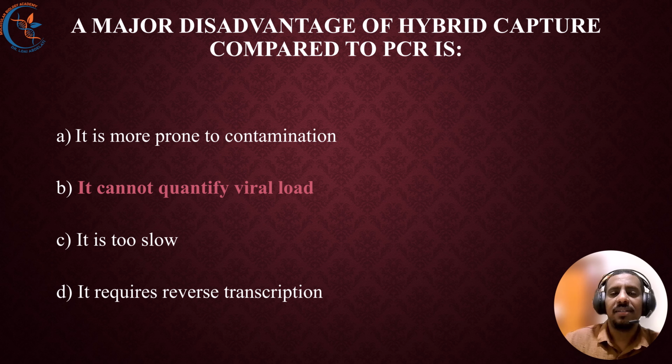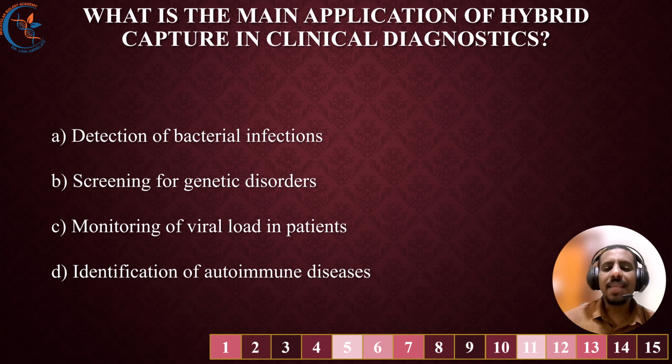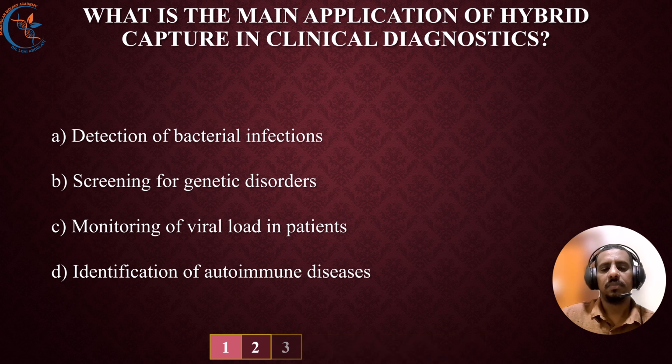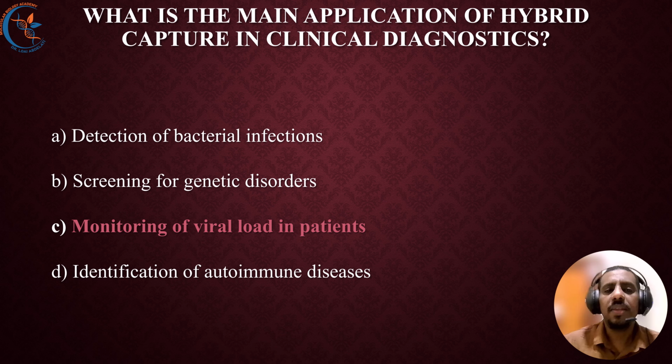Okay? Alright. What is the main application of hybrid capture in clinical diagnostics? The correct answer is monitoring of viral load in patients. Alright, let's move on.